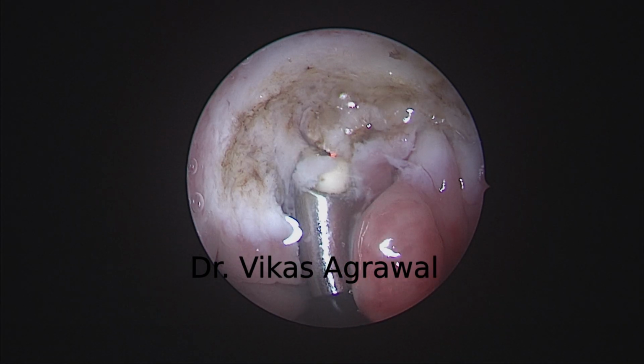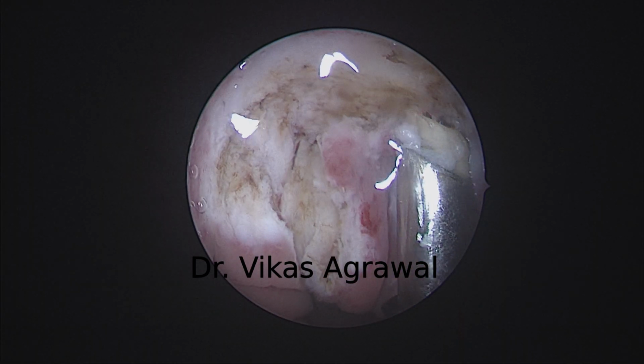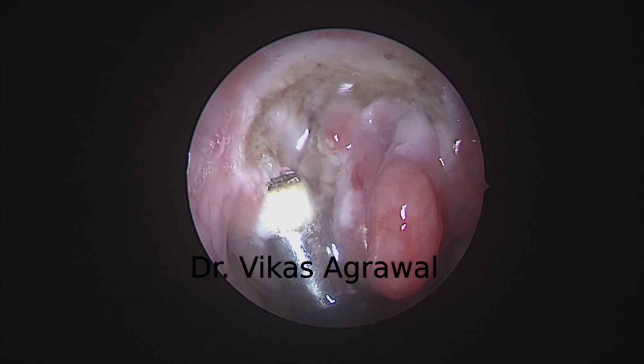And now layer by layer we'll debulk the lymphoid tissues.